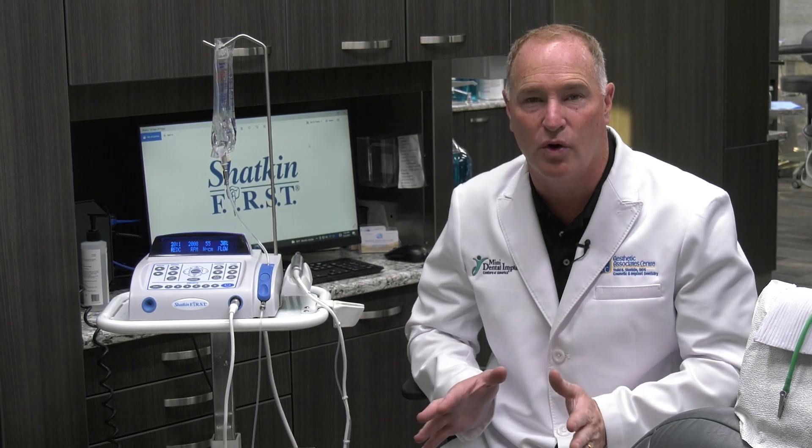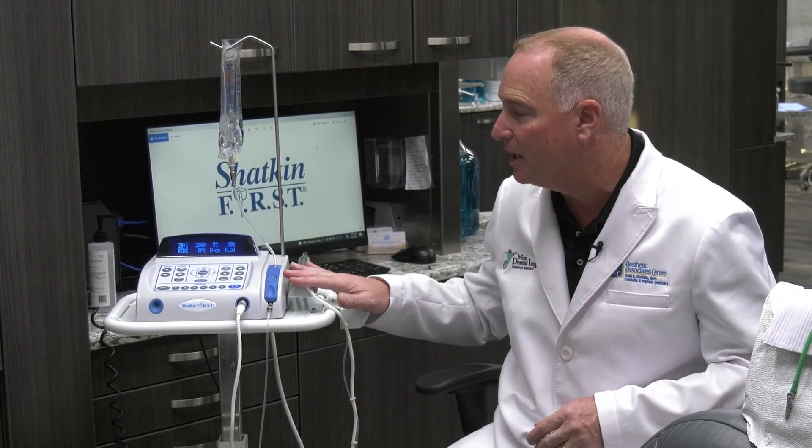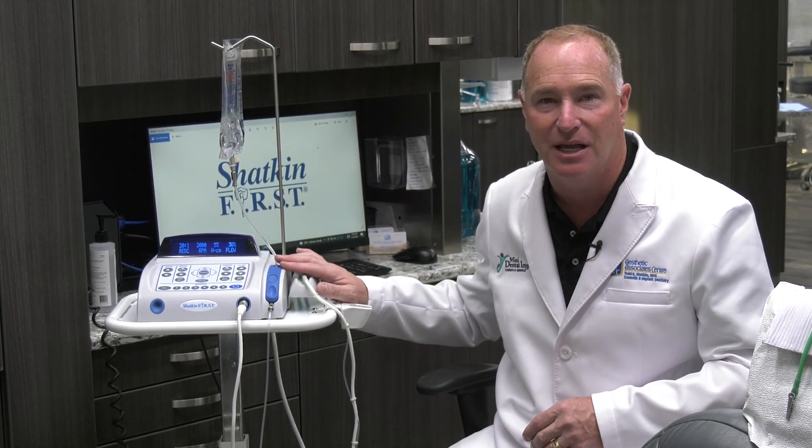It's manufactured for us, private labeled by Aseptico. It's a great motor — it's our workhorse. We use it every day in our office. I've got about five of them in my office. I go from room to room doing mini implants and this machine has been a godsend for our practice.